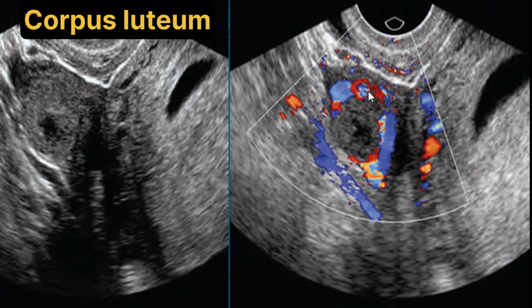And here this one is the transvaginal image of the pelvis with the color Doppler, and here we can see rim of peripheral blood flow around the corpus luteum, and this rim of peripheral blood flow is the sonographic evidence of corpus luteal cyst. And in the sonogram, we can also see the gestational sac that is visualized here, and it contains no yolk sac.